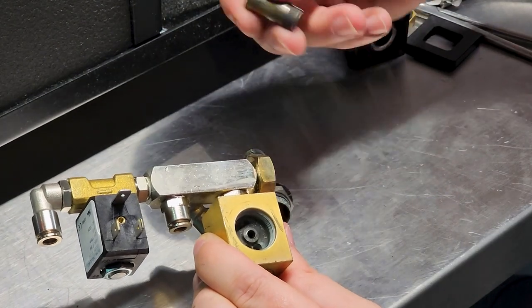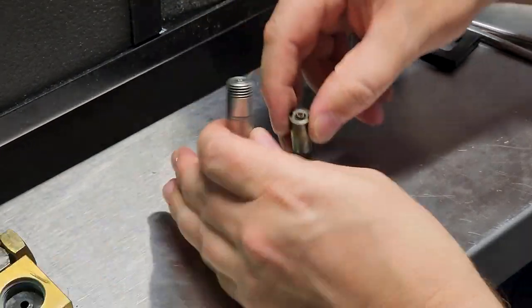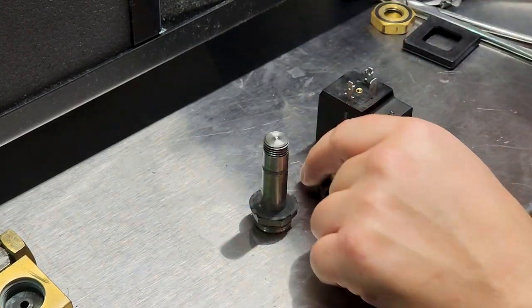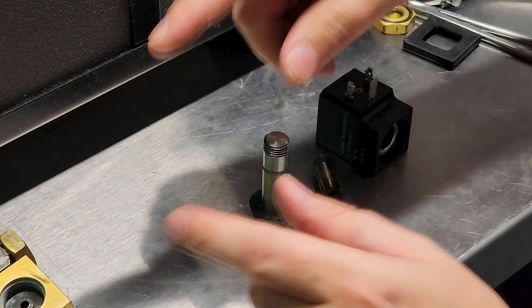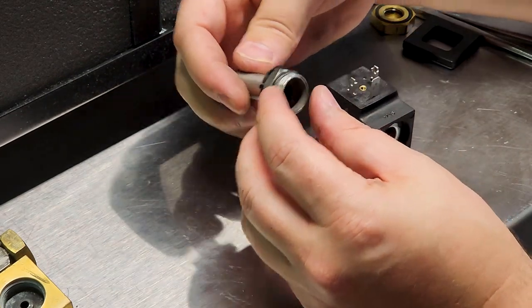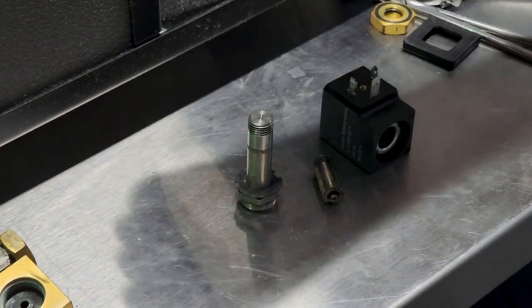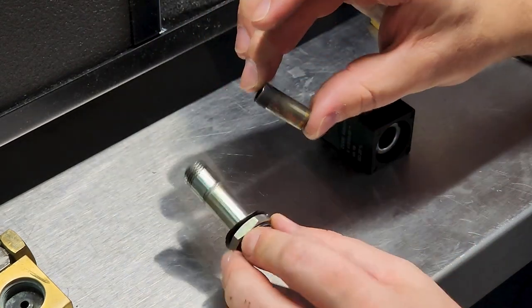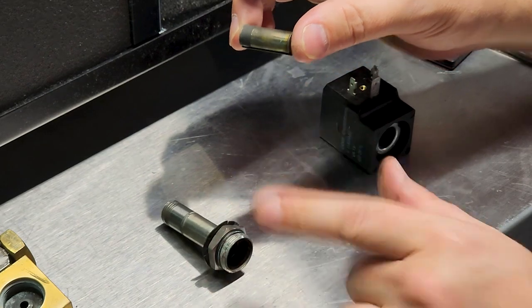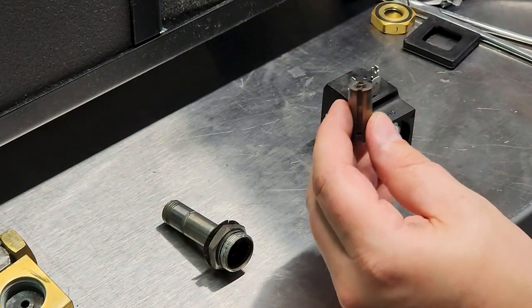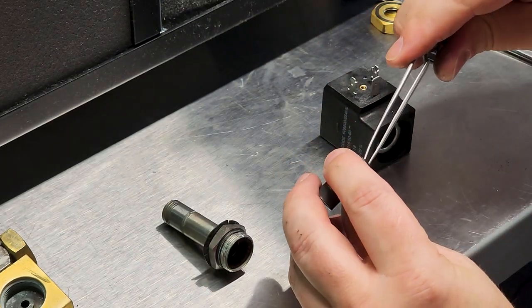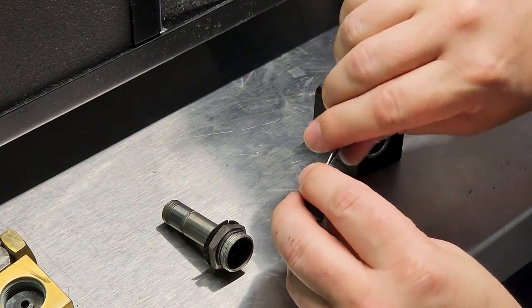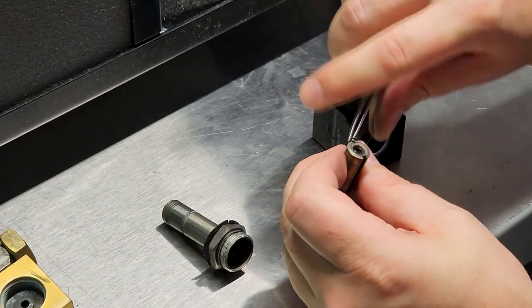These components right here are the rebuildable section of solenoids. Now you could change out the entire manifold and everything, but a lot of these guys for all different types of medical equipment are rebuildable in a kit. And in the kit you'll get that guy, you will get this guy right here, and there internally is going to be a little spring which returns it to its native position.